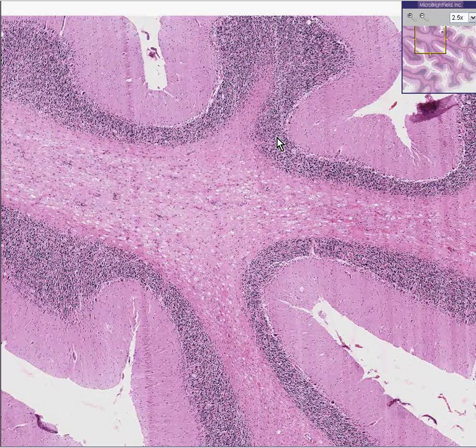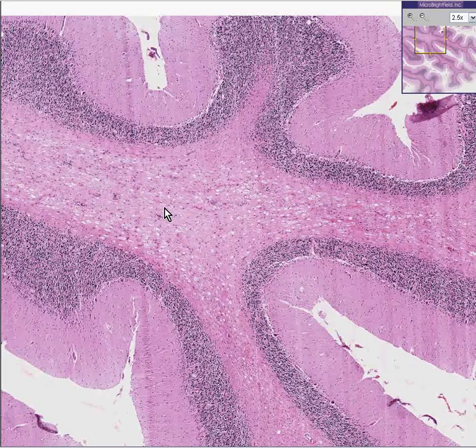In this type of disease, you could instantly see that the white matter is whiter than it should be in some areas, or let's say less pink here relative to here, because of demyelinization. Or perhaps the best word would be defective myelinization, abnormal myelinization.